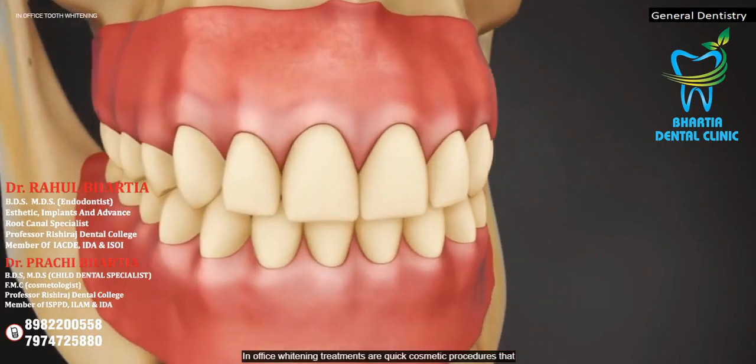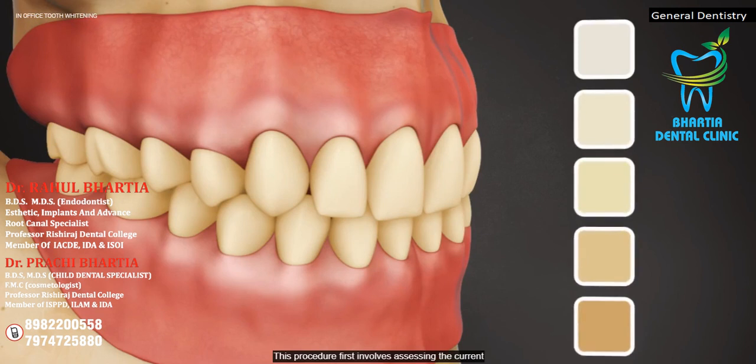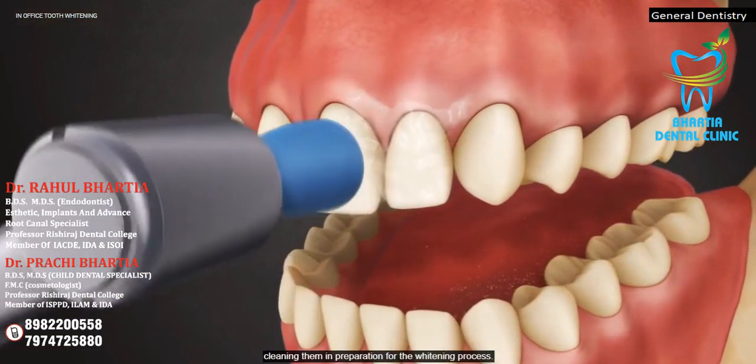In-office whitening treatments are quick cosmetic procedures that enhance and lighten your teeth with light-activated bleaching agents. This procedure first involves assessing the current shade or color of your teeth, then thoroughly cleaning them in preparation for the whitening process.